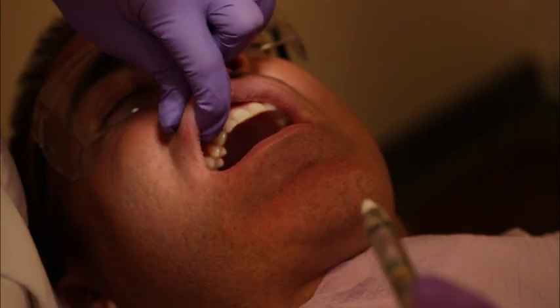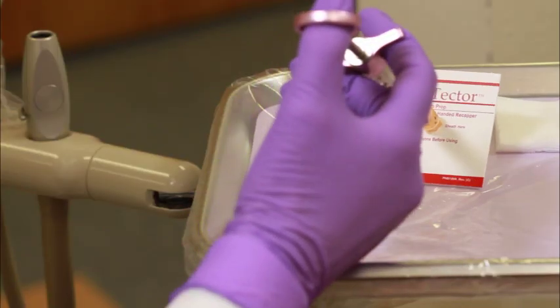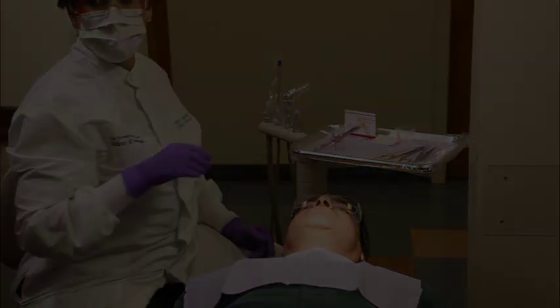Carefully withdraw the syringe and immediately recap the needle using the one-handed scoop method with a needle sheath prop or other recapping device. Wait approximately 3 to 5 minutes until anesthesia takes effect before beginning treatment.